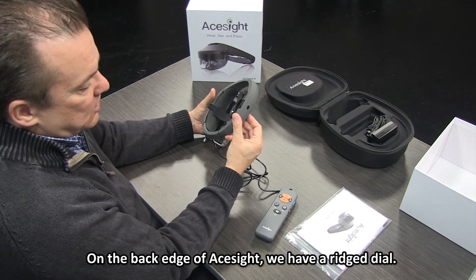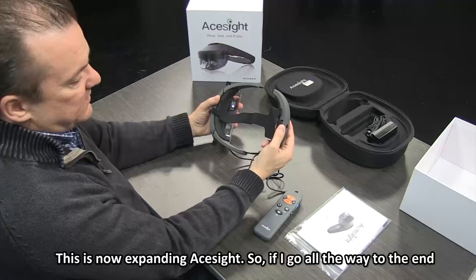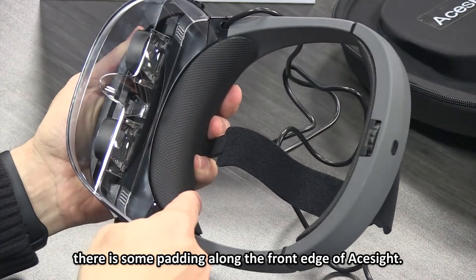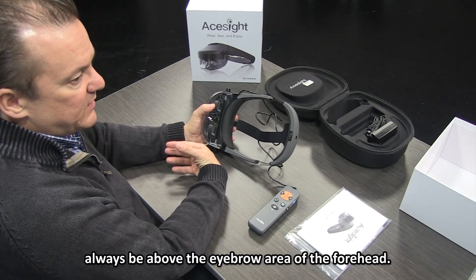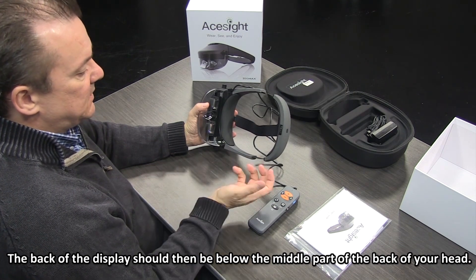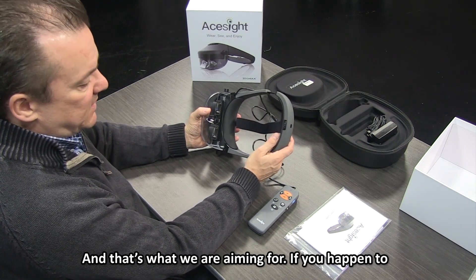On the back edge of ACE Sight we have a ridged dial. As I turn it to the left to loosen it, you can hear it clicking — this is expanding ACE Sight. It expands by just under two inches in length. There is padding along the front edge and also at the back. The padding at the front should always be above the eyebrow area of the forehead — that's a good starting point. The back of the display should be below the middle part of the back of your head. Once tightened to a comfortable fit, you're good to go.